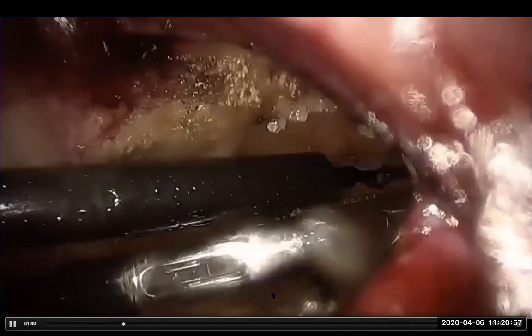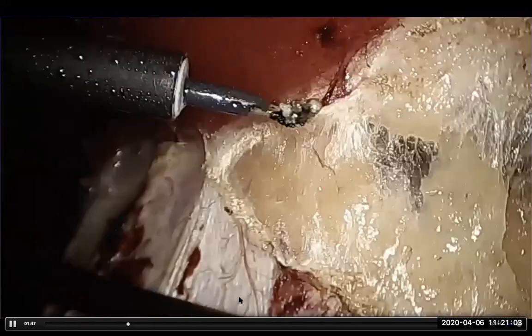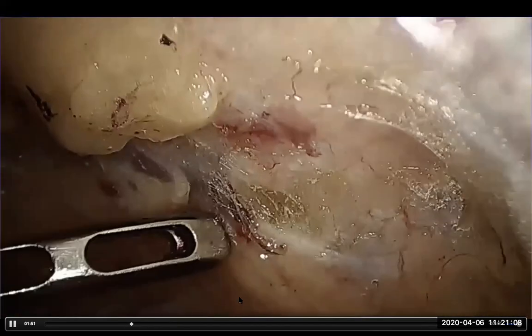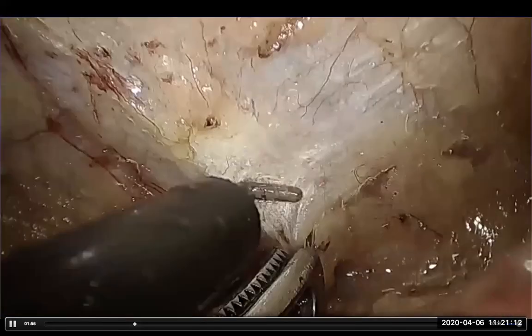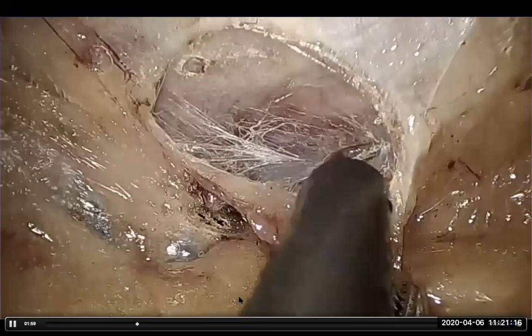So because we have already shown the eTEP RS, I will kind of fast forward most of these places where you don't have anything new, but I will keep the video focused more on where you have the tacks and the sutures, right?